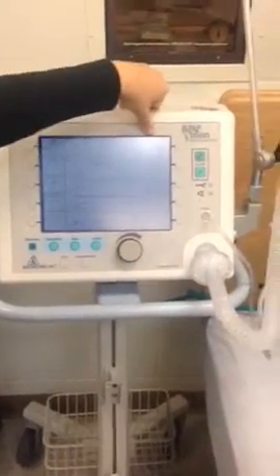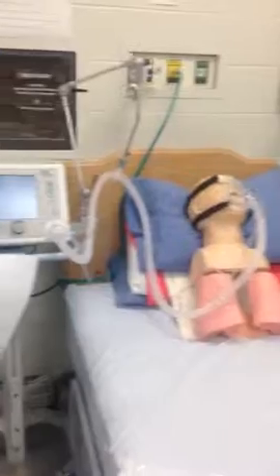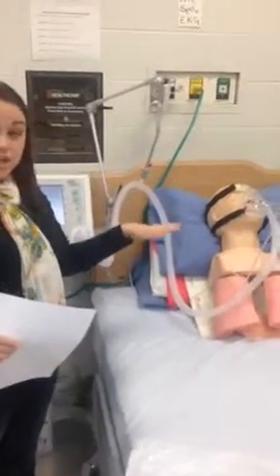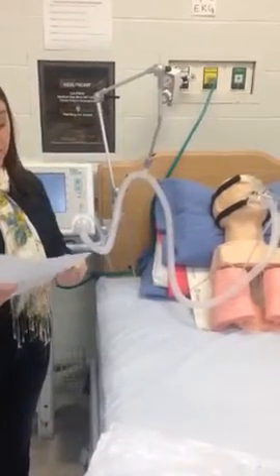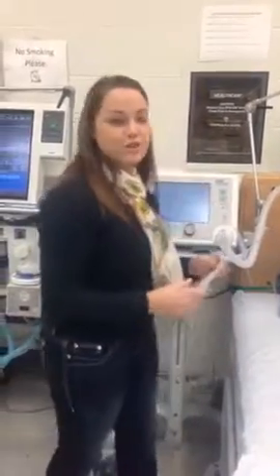alarming every 5 seconds. So basically, once you have somebody on the BiPAP, you want to make sure that your IPAP and EPAP are satisfactory by you're going to assess the patient. You want her to reach a good tidal volume, and she is pulling a tidal volume of 400 mils. I'm going to go ahead and turn that off so it stops alarming.